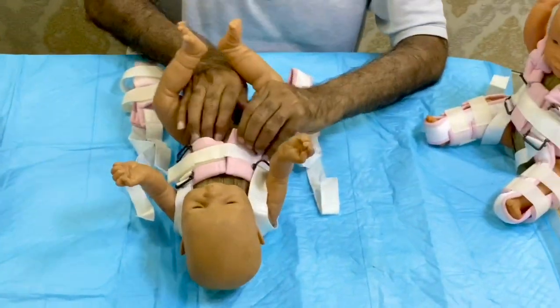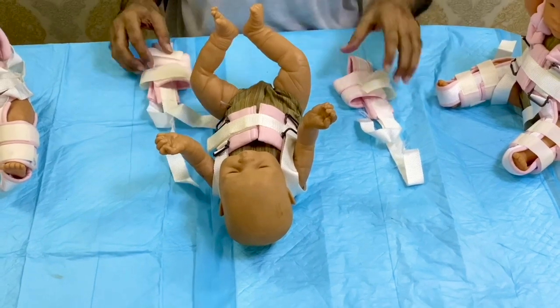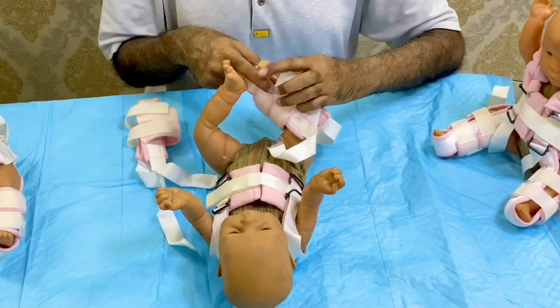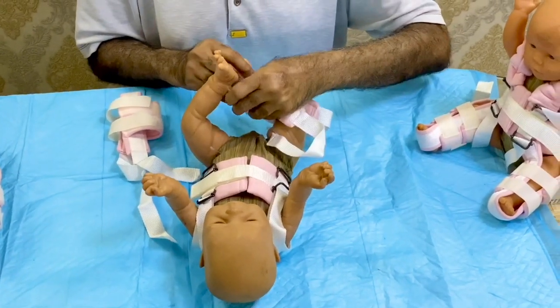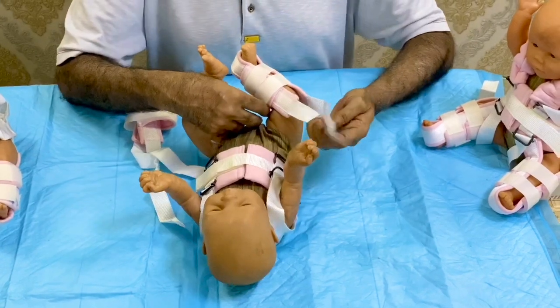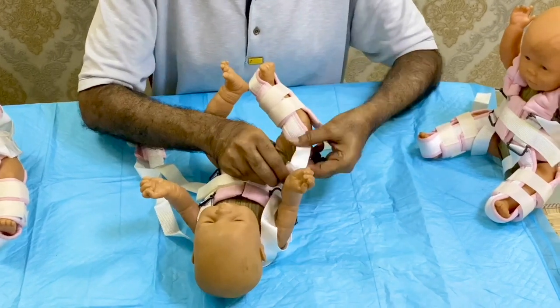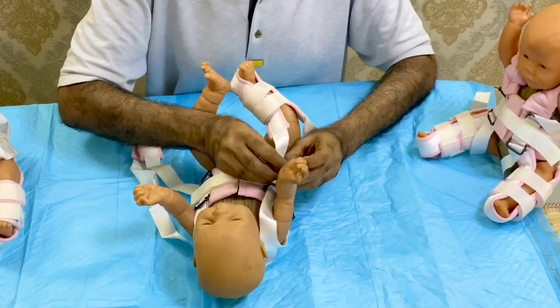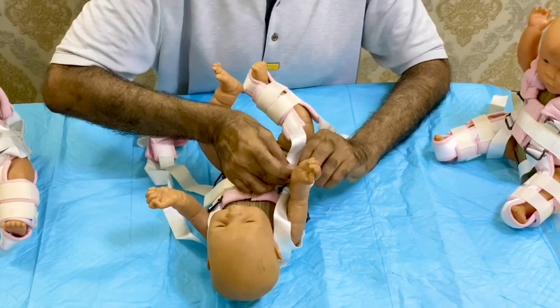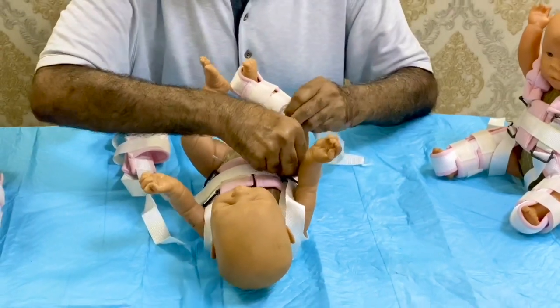Check the position and stability again. Now the foot straps have to be fixed — this is the far heel, and these are the buckles for stability around the leg. Once you apply this, you will maintain the position in abduction and flexion. This is the flexor strap — apply this flexor strap and fix it at the 90-degree desirable position, but it can go up to 110 degrees, not over 110 degrees, for the flexion of the hip.